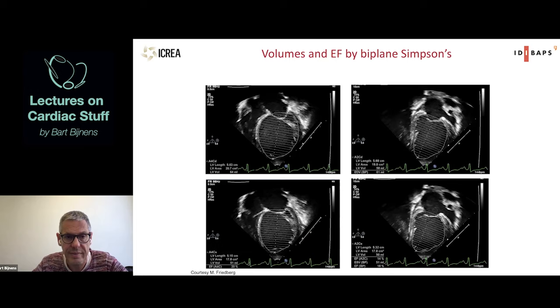One of the things that you see is that when you start to do these delineations, things are not always that obvious. For example, what do you do with trabeculation? So you have to cut these trabeculations. What do you do with dropout of the images? Because especially in dilated hearts in echocardiography, you see dropouts. It's like, what is the endocardium and what is the epicardium? So here, this is a child, so it's quite easy to see, but very often, in adult hearts, it's not that easy to see. So still you see that there's a lot of potential errors there.